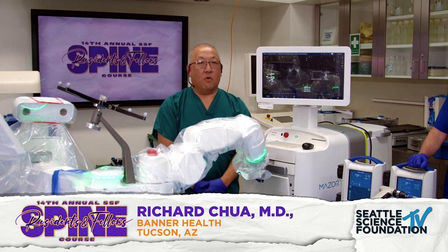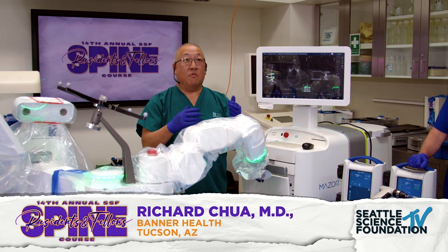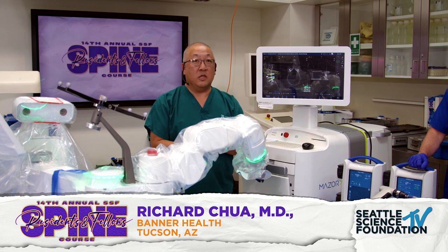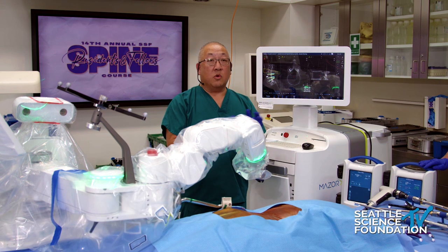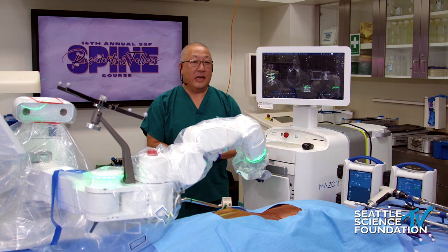We have a cadaver lab set up for a Mazor. We're going to demonstrate percutaneous navigated robotic assisted pedicle screw placement in lumbar spine. Want to thank Medtronic and Mazor, Jud Hunter, and a couple of other folks here who are supporting it.